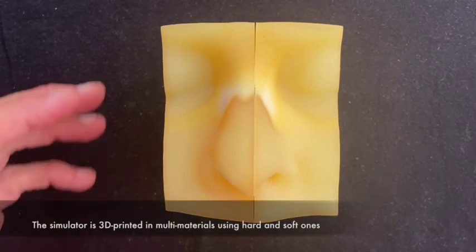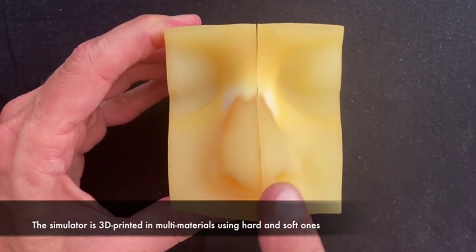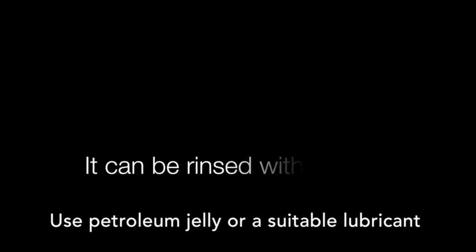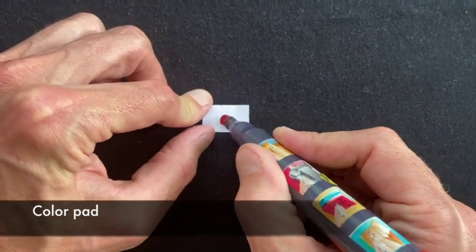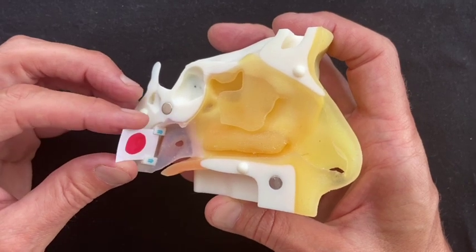This simulator is 3D printed in multi-materials, using hard and soft ones. We recommend the use of petroleum jelly or a suitable lubricant to facilitate gliding of the swab. The simulator can be rinsed with water. Slots on the posterior wall of the nasopharynx allow fitting of a replaceable colored pad.